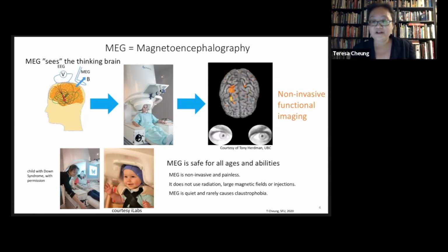There's no other preparation that's needed. There are up to 300 MEG channels that surround this person's head when you put the head inside the device. So imagine having to do this now with 300 EEG electrodes. That's a large and hard process, not fun for either the technologist or the patient. But with MEG, you can measure many, many more places around the head than you can with EEG. And this might help you better pinpoint locations where the brain activity might be useful, such as where epilepsy may be occurring.